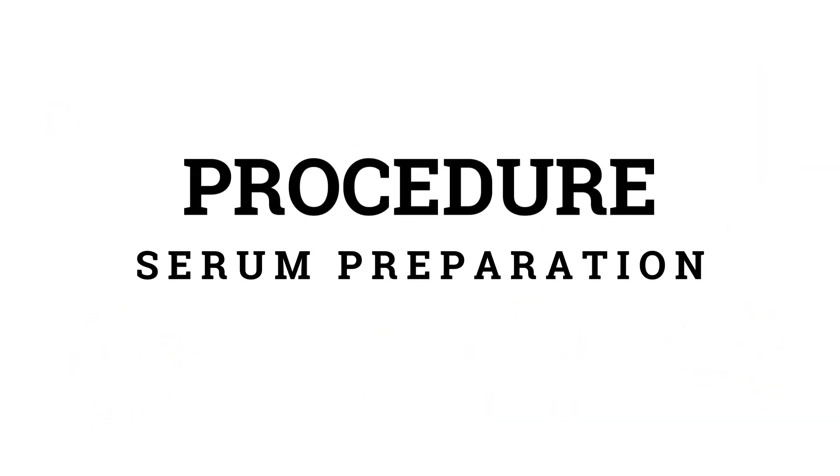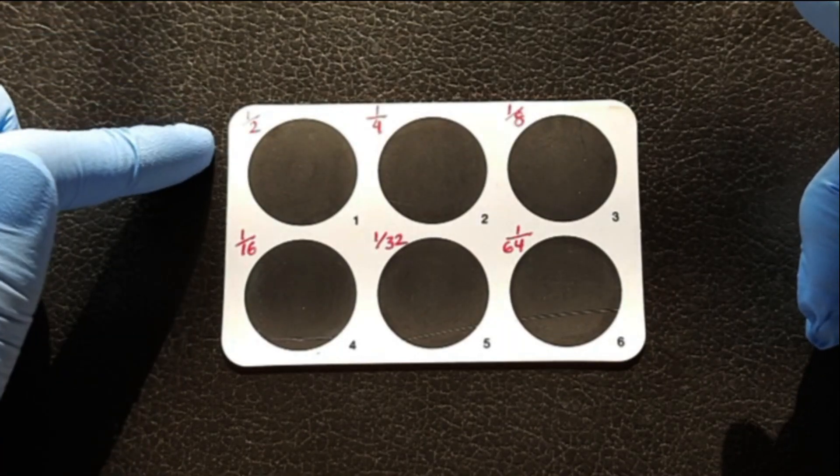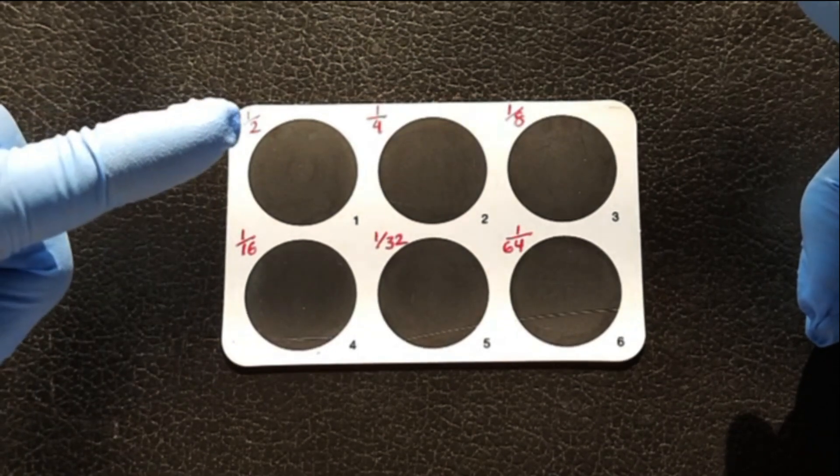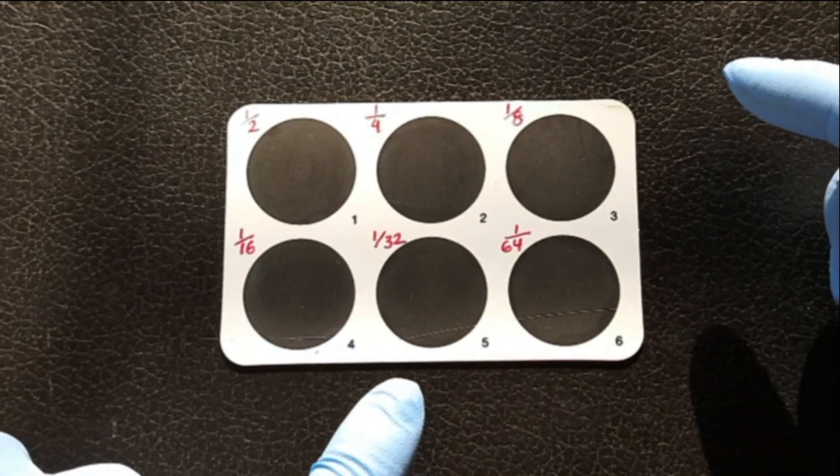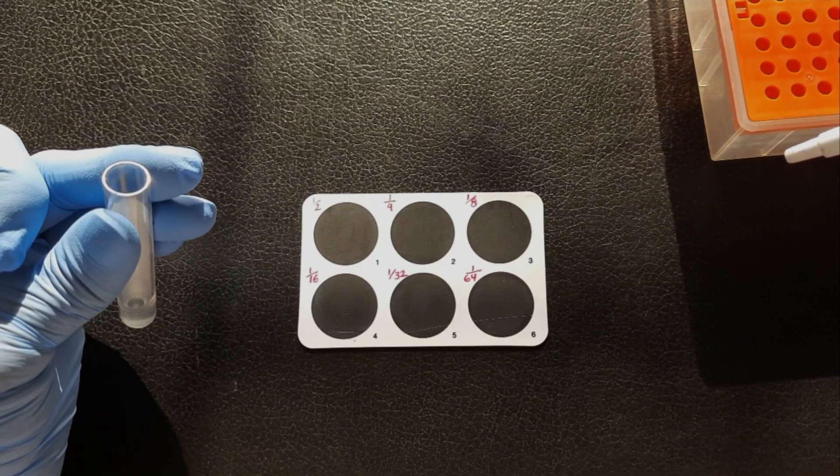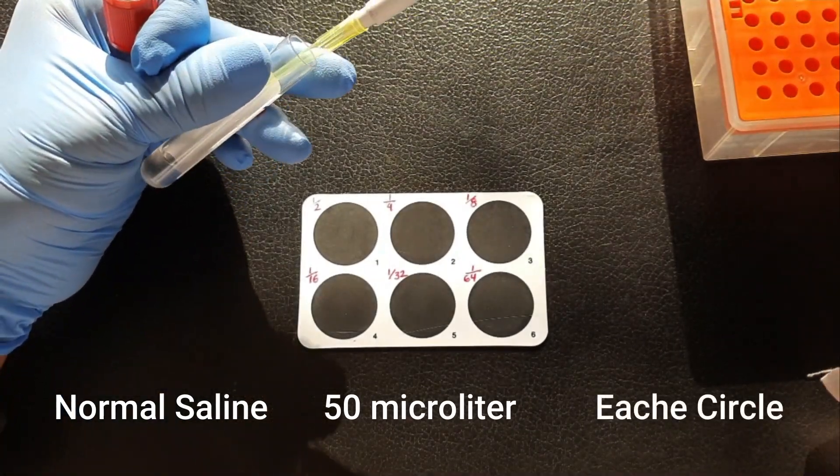To prepare the serial dilution of serum, first we will take a test card, having 6 circles, and label the circle 1 to 6 as 1 in 2, 1 in 4, 1 in 8, 1 in 16, 1 in 32, and 1 in 64. Now, you have to place 50 microliter of normal saline on each circle by a micro pipette.